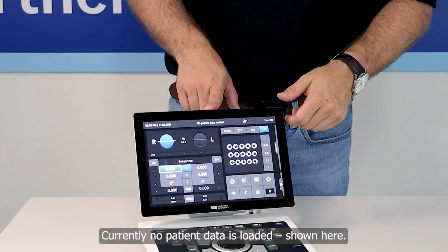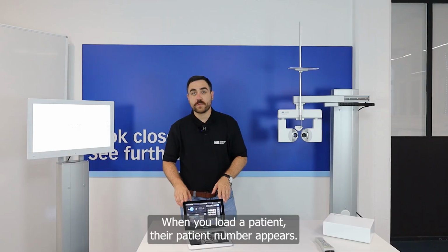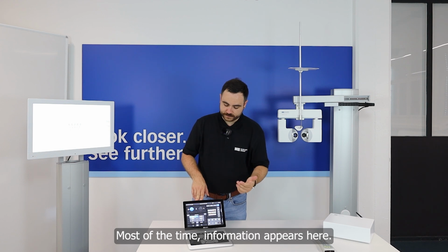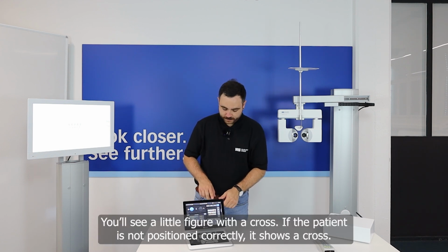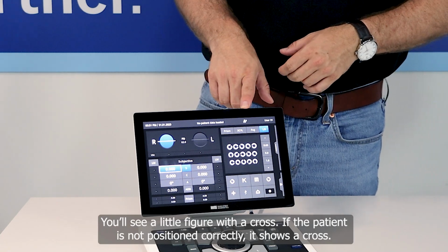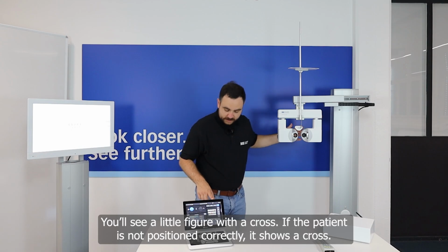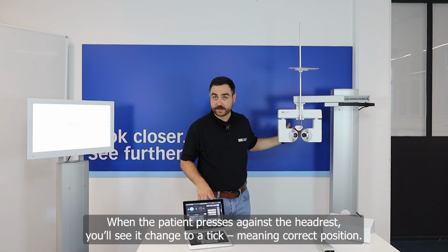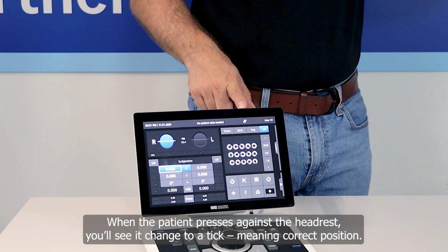If you load patients, the patient number will also be shown, and here are most of the time information bars. Here you can see this little man with a cross. If the patient is not in position, it shows the cross. If you press against the forehead rest, you can see now there's a tick. That means that the patient is in the correct position.